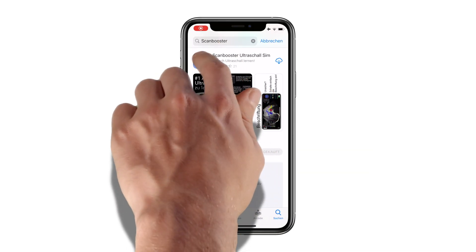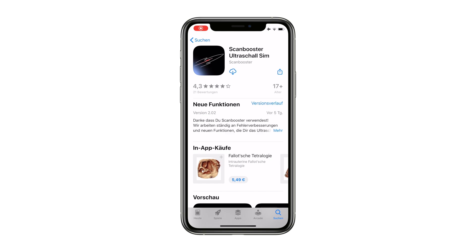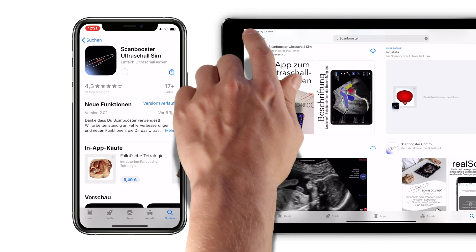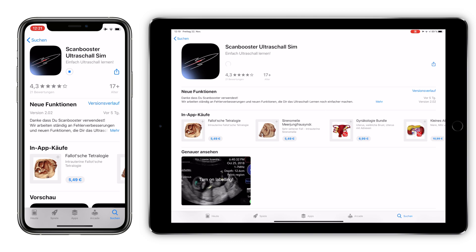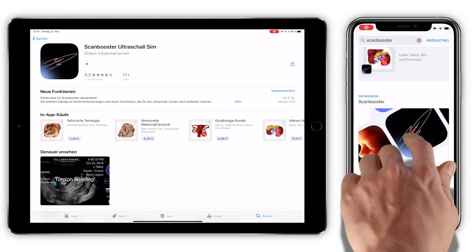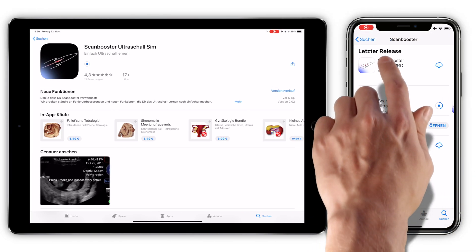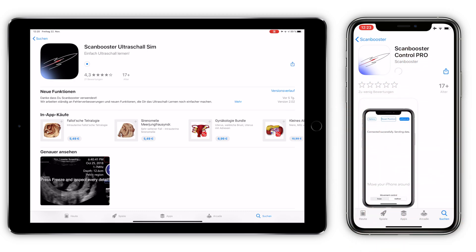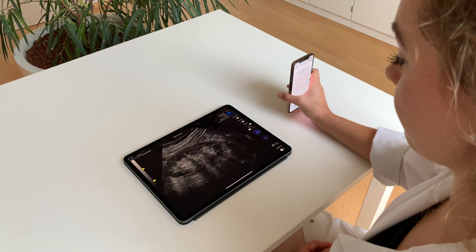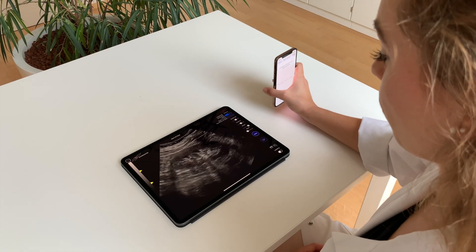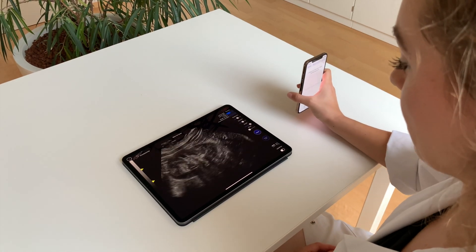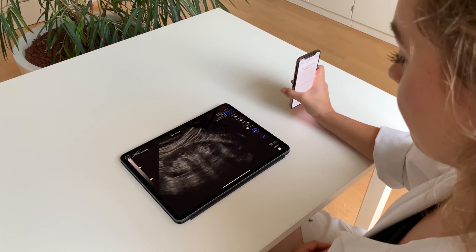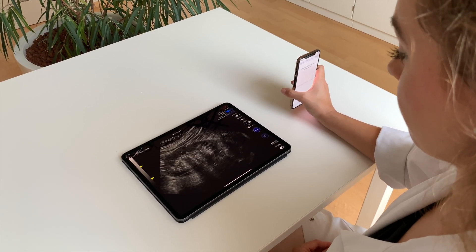Step 2: Install. You can now download ScanBooster Ultrasound Simulator to your iPhone and iPad. If you have both devices available, you can download ScanBooster Control Pro to your iPhone. This will transform your iPhone into a virtual ultrasound probe to control ScanBooster on your iPad.